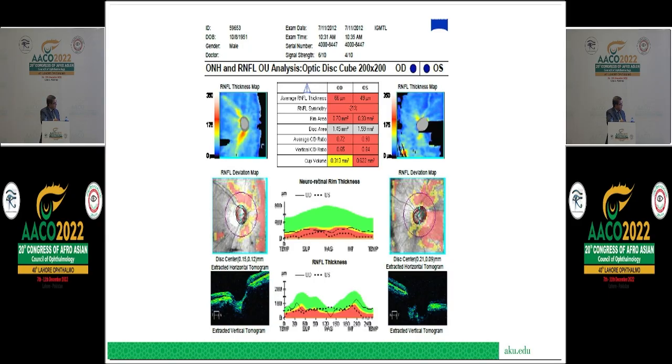Well, there is some area where there is a rectangle of missing information, okay? Now, that could be because of movement, blinking, so many different things. But there's definitely missing information. So when the analysis is done, right, it is showing you all this red spot and dips. But really, this is all capturing missing information. So it is not very useful.